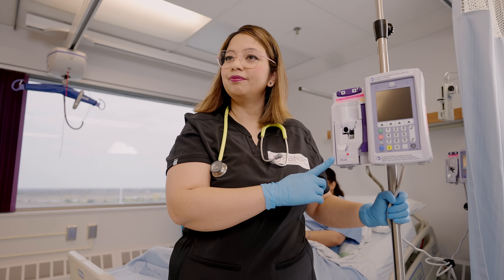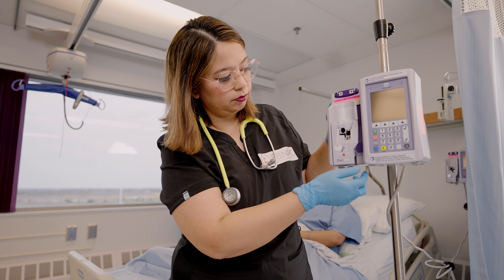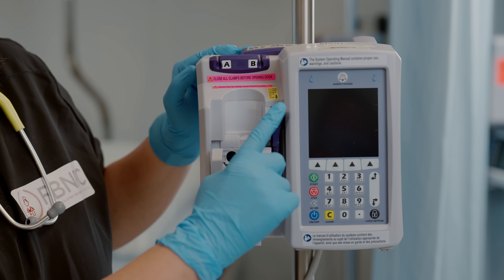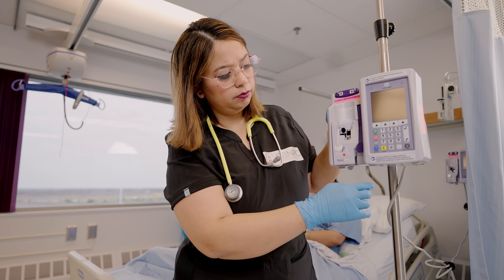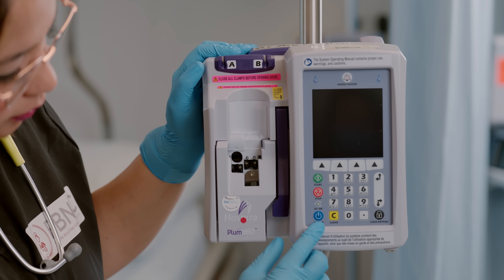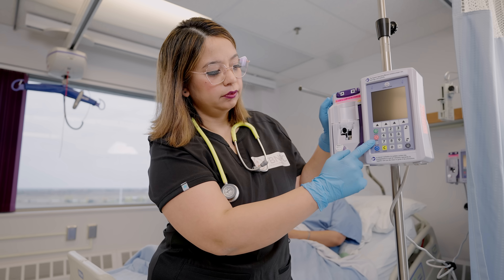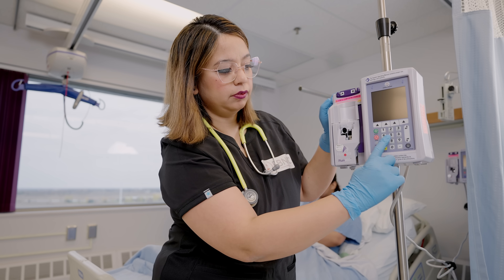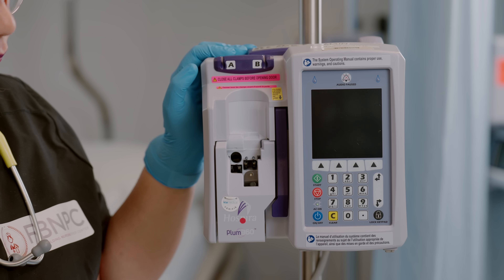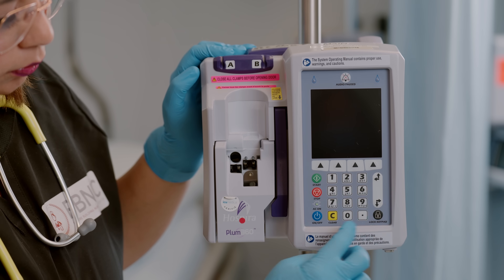This pump has physical features to review. You can see tubing line guide A and tubing line guide B. There is also a lever that goes up and down — it opens to load the cassette into the door. Looking at the soft keys: the blue soft key turns the pump on and off, the green soft key lets fluid flow, and the red key stops the fluid. There are also alphanumeric keys for coding and setting up medications prescribed by the physician, and arrow buttons to select different medications or CCAs — the different units the patient is admitted on.